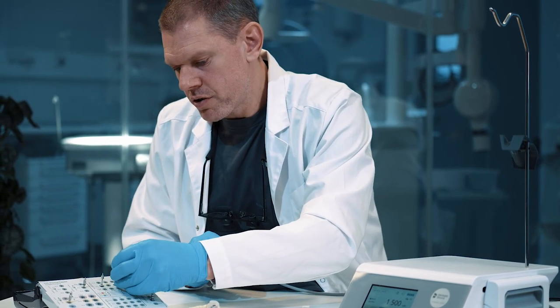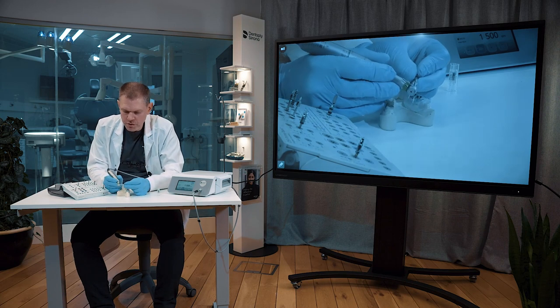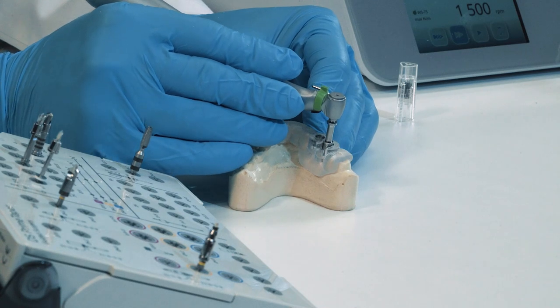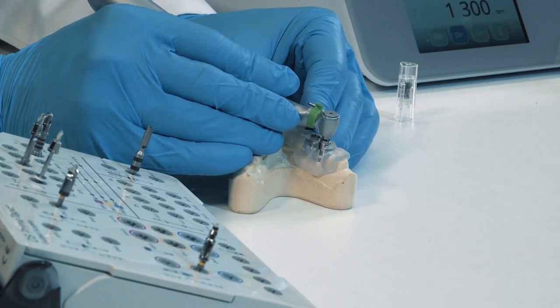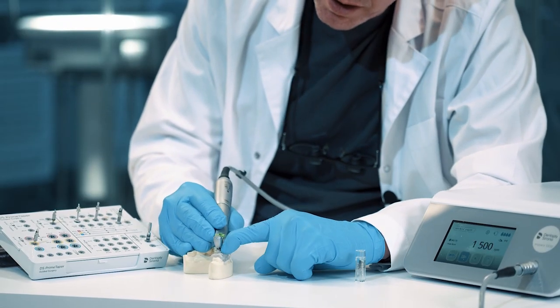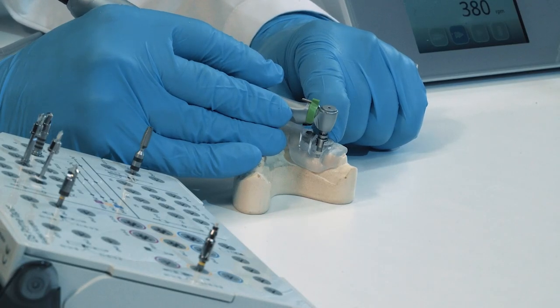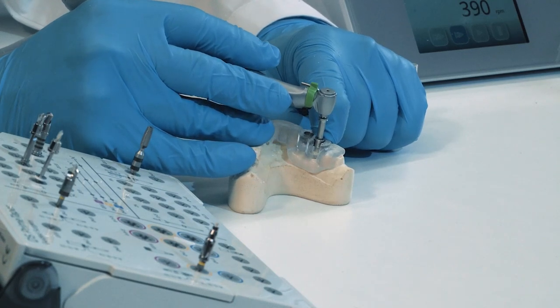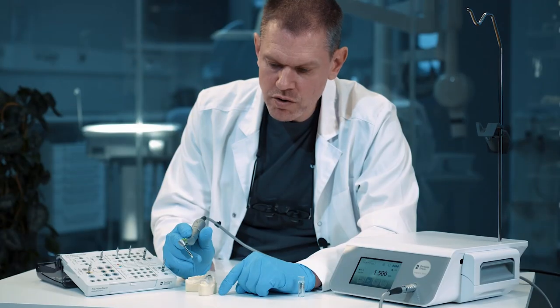Next step: drill number four, same procedure again. Put it in from the side, start drilling. Stop for a moment and control that you can go out without bringing the sleeve with you, then reverse until you are in the position where you are no longer drilling in the bone.